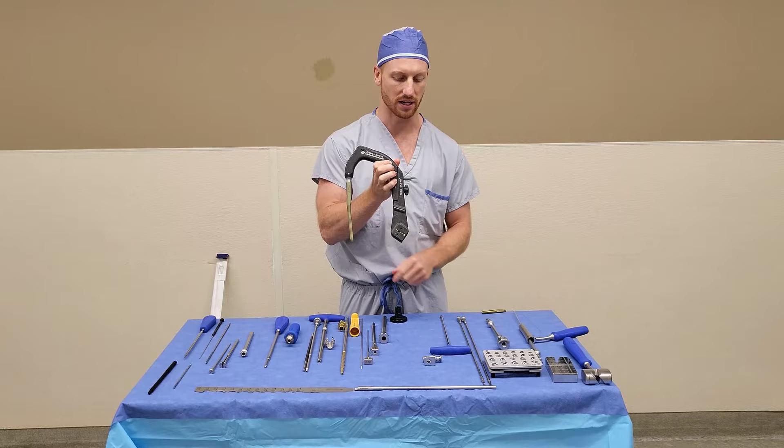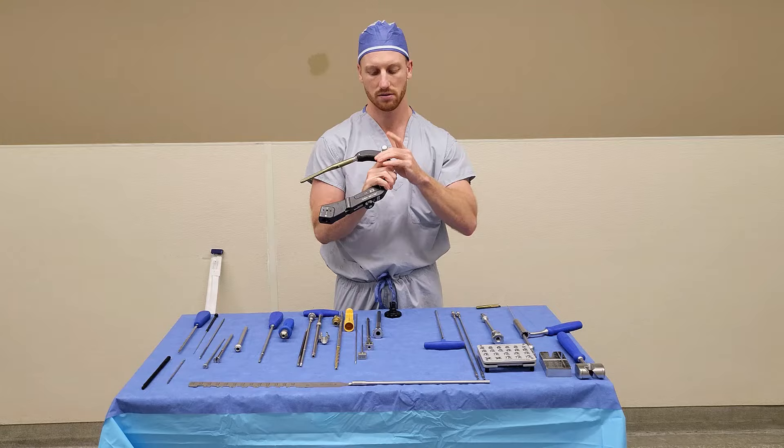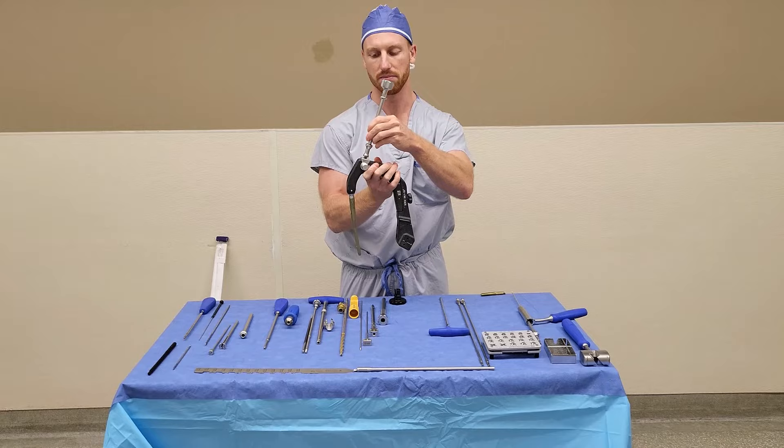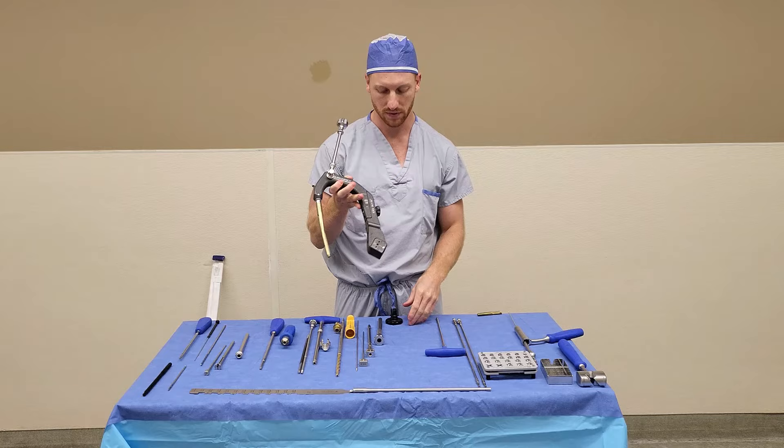You then need to insert your impactor. To insert your impactor, you take the clip, throw it inside like so, and then screw on your impactor tip. At this point, you can hand this assembly up to the surgeon.